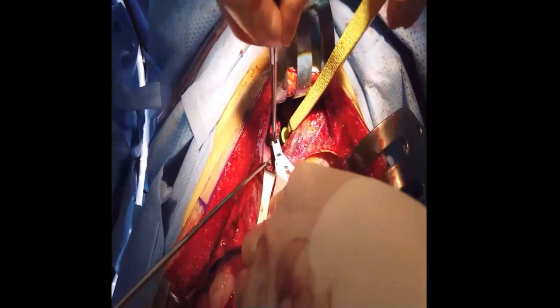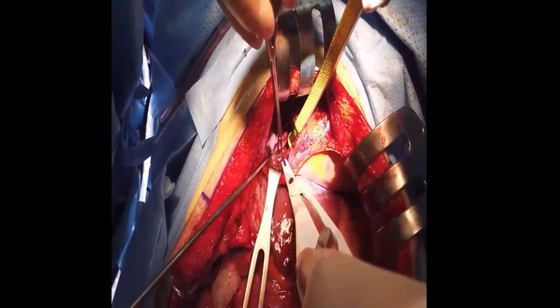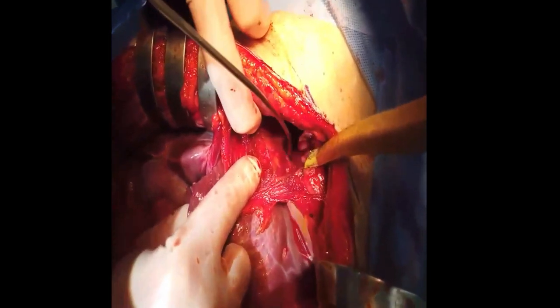For safe dissection, a silicone-based flexible retractor is useful to expose the lymph node by softly compressing the right heart. You can see the mildly compressed heart by the flexible retractor.